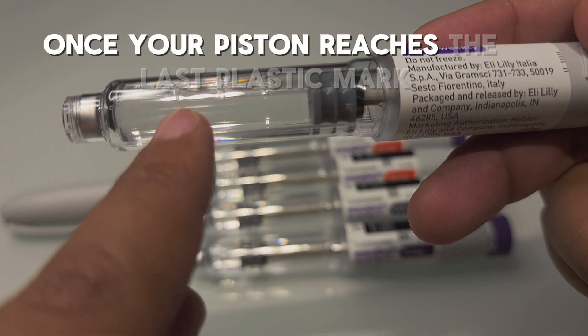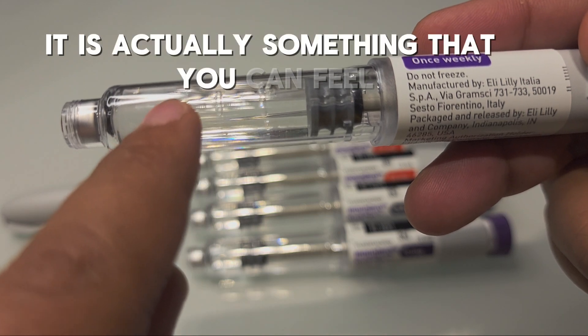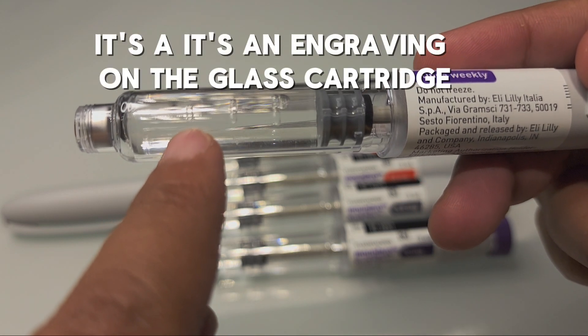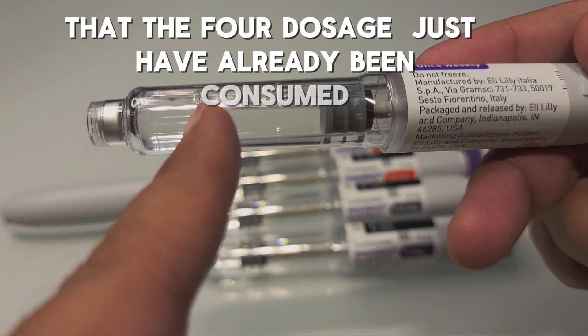Once your piston reaches the last plastic mark — it is actually something you can feel, it is an engraving on the glass cartridge — you can be sure and certain that the four doses have already been consumed.